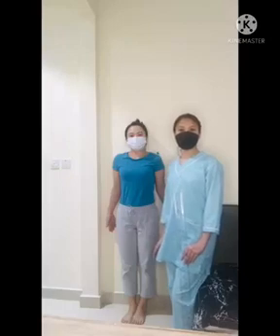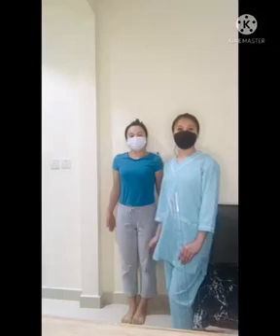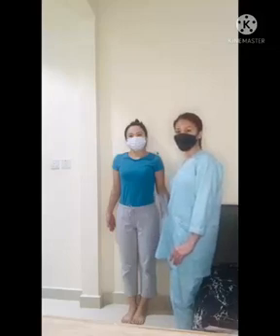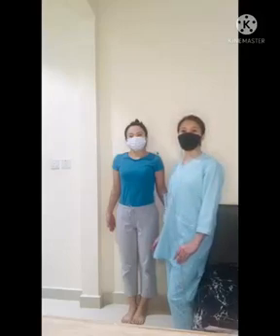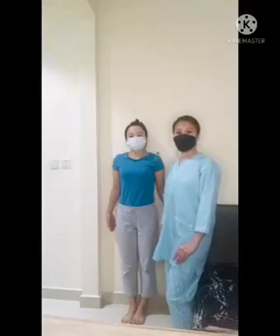Center the MSP of the body to the midline of the IR, with the upper border of the IR placed 1.5 to 2 inches above the shoulder. If possible, flex the elbow with the palm of the hand on the hips. Adjust the shoulders to lie in the same transverse plane.